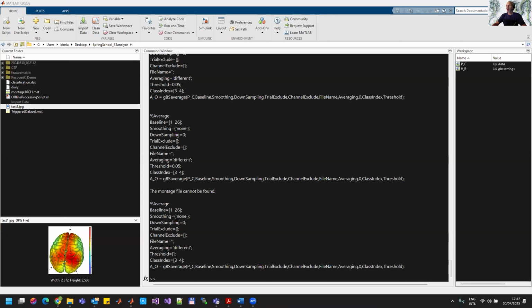Maybe you can explain how we are doing it in RecoverX. In RecoverX, the patient sees an avatar. He sees the hands, and the cue comes up from the table instructing him to move the right hand or the left hand. In the machine learning phase, the avatar performs the movement, and at the same time the neurostimulator starts inducing the hand opening.